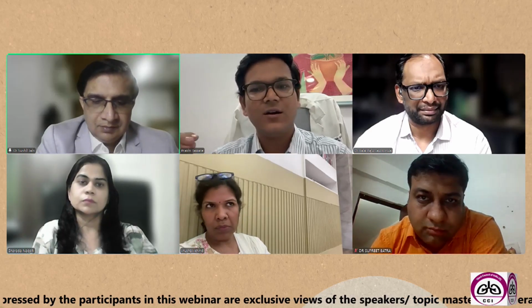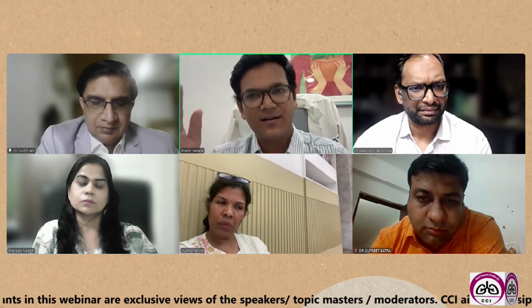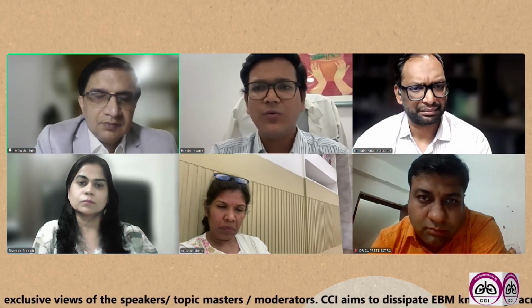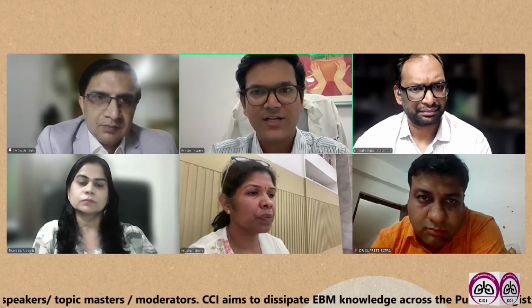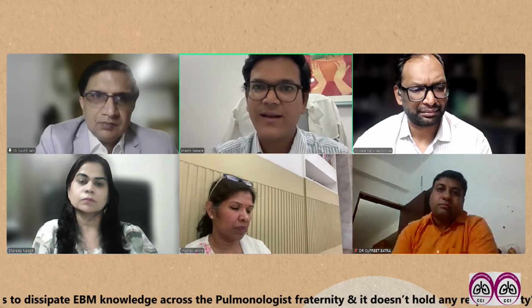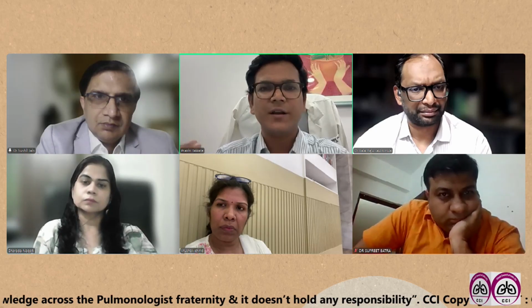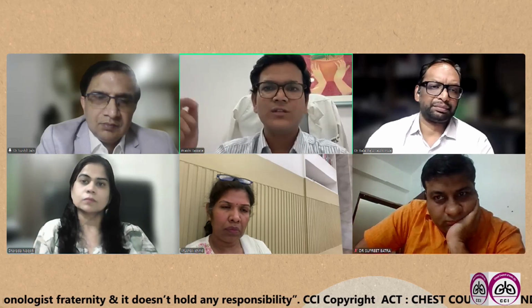Or if the cough is not so intense, then you can keep the needle inside and ask the anesthetist to deepen the sedation and then continue. Or if the anesthesiologist is not comfortable with IV sedation, then you can proceed with general anesthesia or controlled ventilation, like in a few cases we do, and ask the anesthetist to give a relaxant if you require it, because a lot of times there are a lot of respiratory movements, and that's why sometimes your vision gets lost.